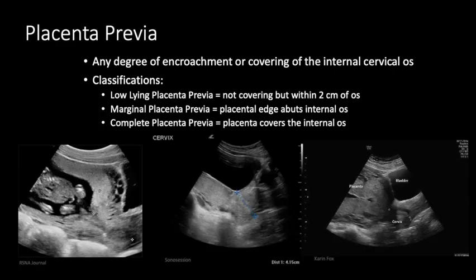Now, the placenta appears to migrate, usually more fundally as the pregnancy progresses. So this warrants future follow-ups if you do happen to notice this early on in pregnancy. However, the difficulty of assessing this and the care and delicacy with which you have to examine these patients often means that we need to be formally ultrasounding them through a radiology department.